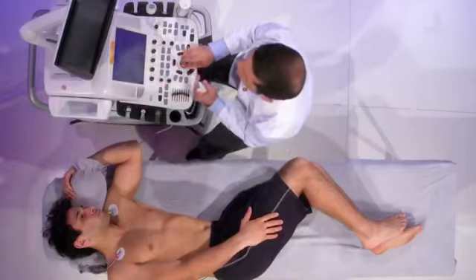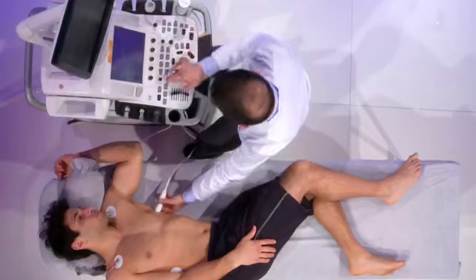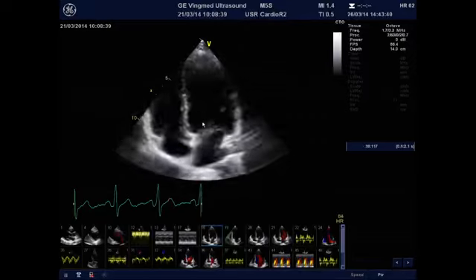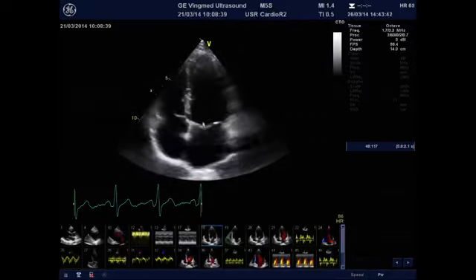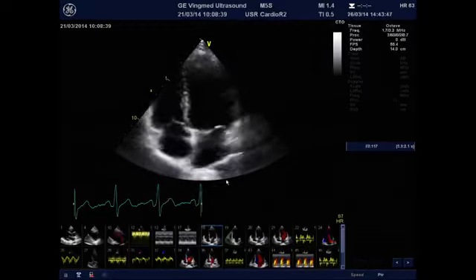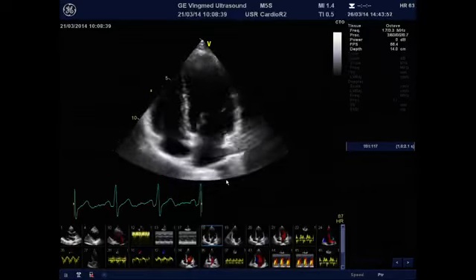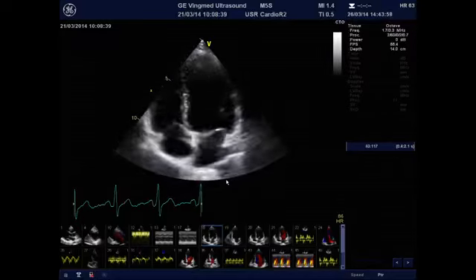What is important about the volume of the left atrium is that it not only reflects the severity of diastolic dysfunction, but it also reflects the chronicity of the disease, because the size of the left atrium doesn't change overnight. As it has been said, the volume of the left atrium is in a way the glycated hemoglobin of diastolic dysfunction, because it reflects not only the instantaneous increase in LV pressure, but also the chronicity of the disease.